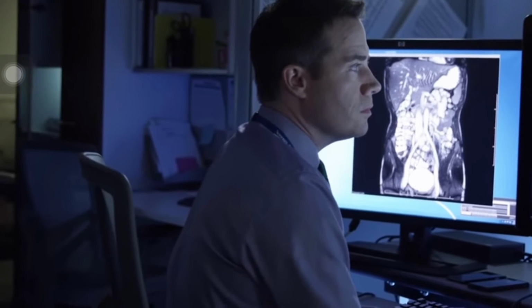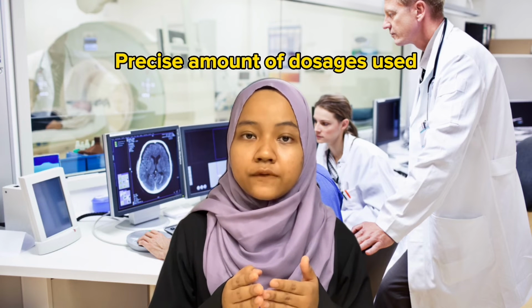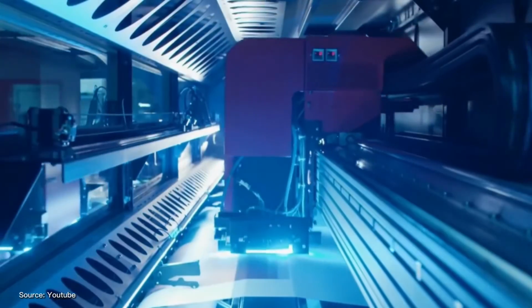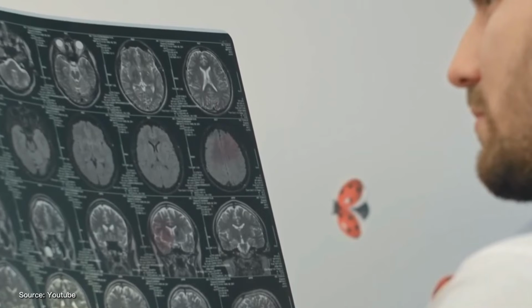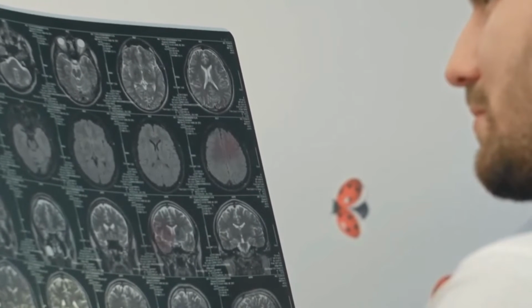For example, track and record radiation information. Dicom was also developed to help medical practitioners plan the precise amounts of dosage used for radiation therapy. Besides, Dicom verifies compliance with the standard by detailing values for some data. For example, right and left are the mandatory options for the laterality attribute.